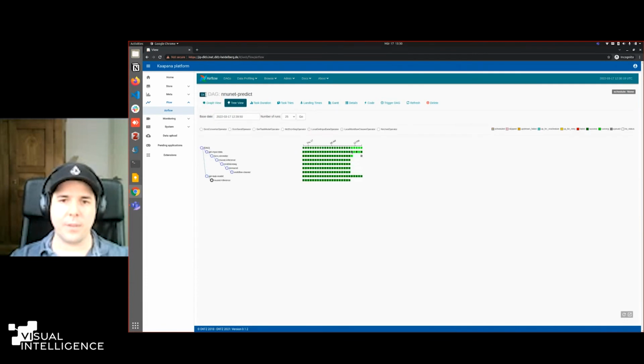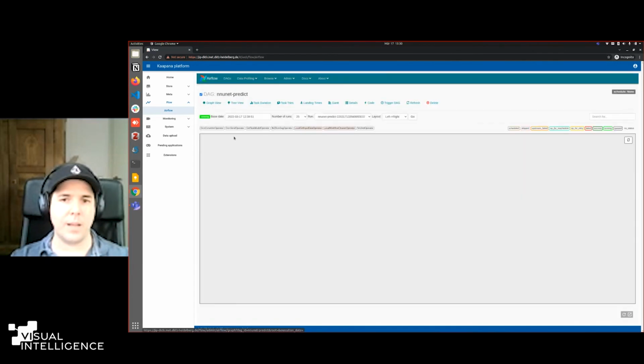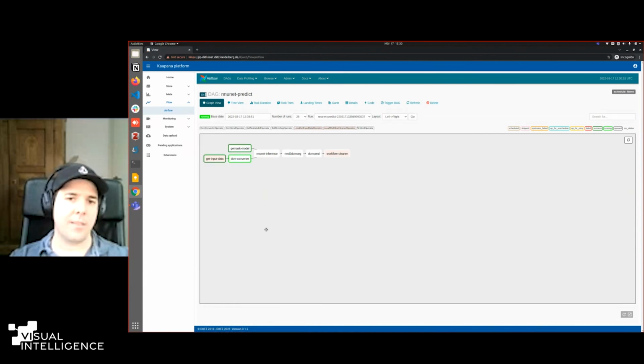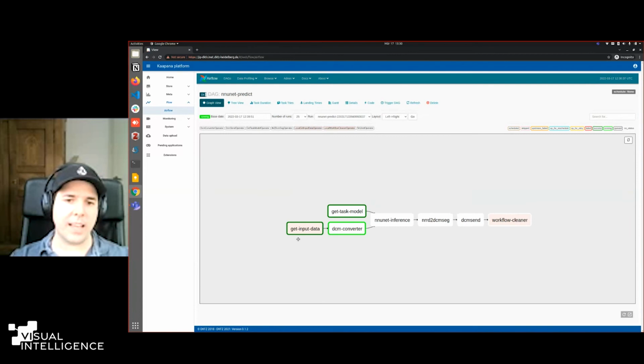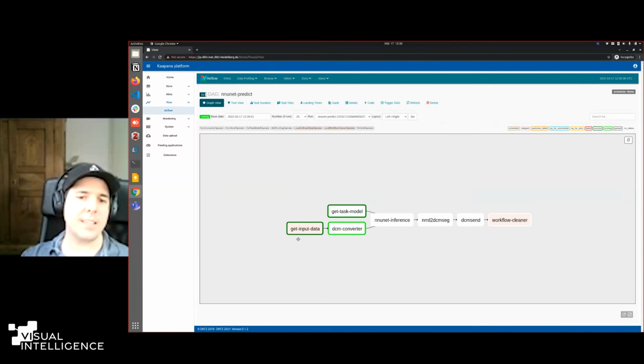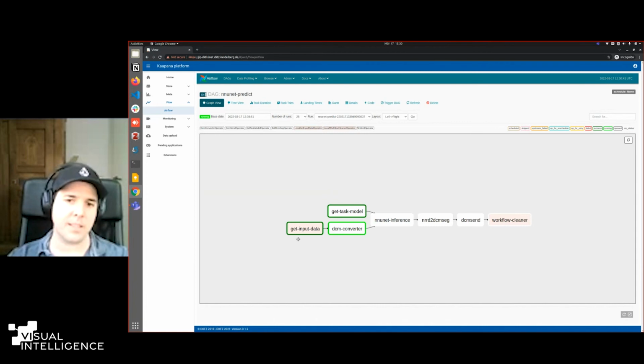You can also have a look in a different view. So you see the 5 images I just selected, the 5 CTs, have now triggered their own run of this prediction pipeline, and they run in parallel. And you can basically see in this view how, step by step, they will be predicted. In this case, how it works, it starts with the get input data. So this will actually pull the data we selected on the dashboard. It will collect the data from the PACS system in the system.